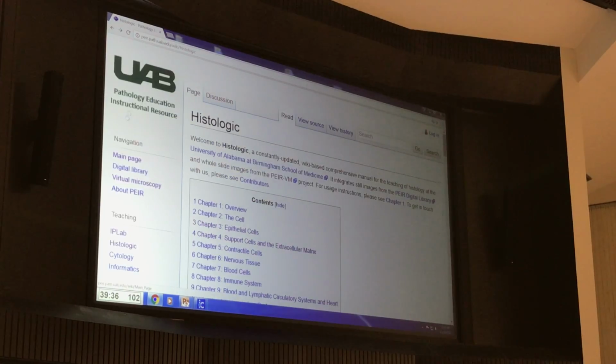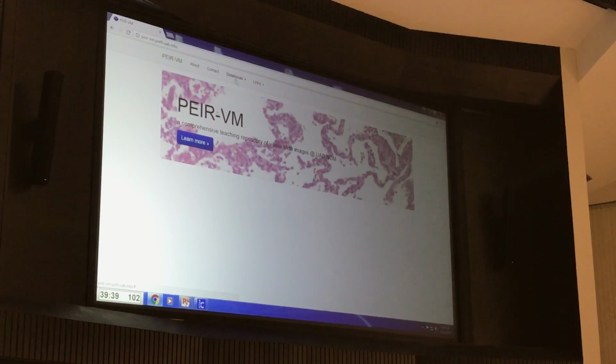Let me show you what the elastic fibers will look like.